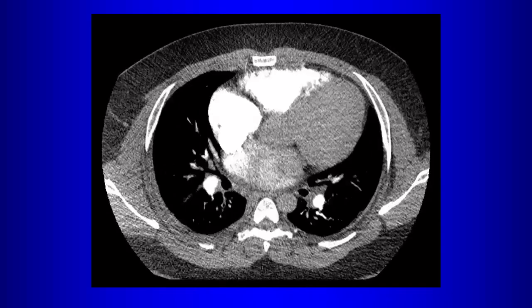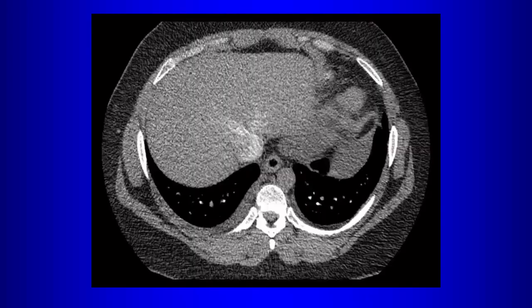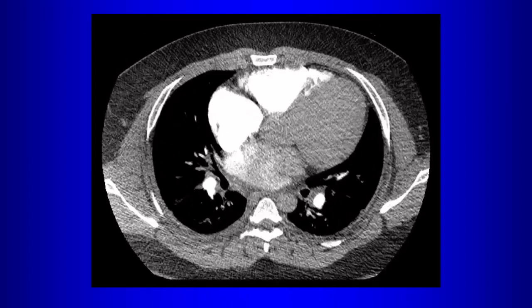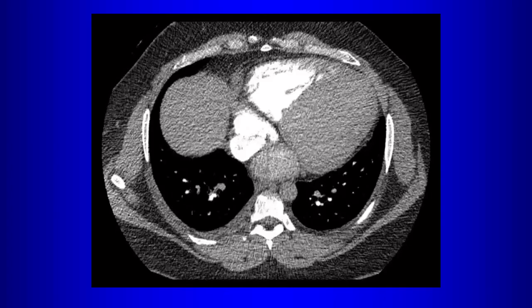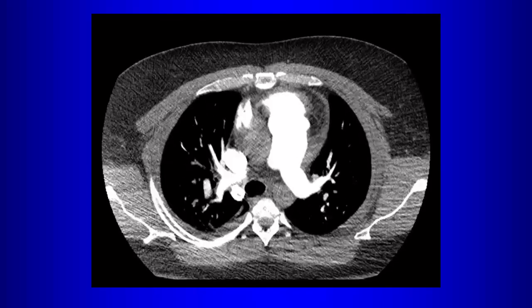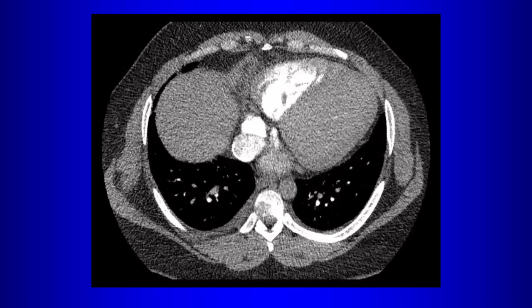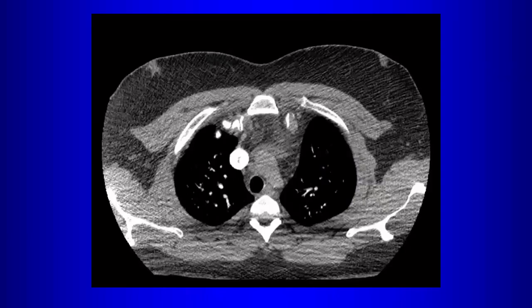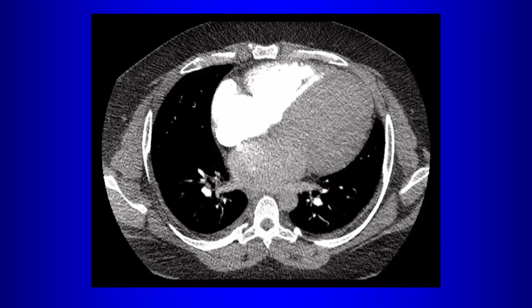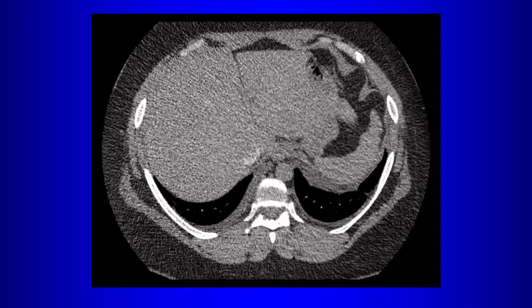It could have just been they scanned it early, though, right? Well, what's the protocol for scanning? How do they know to scan at the right time? They put an ROI over the main pulmonary artery. And then what happens? Then the patient goes in, right? You haven't quite explained what happens. So you put an ROI over the pulmonary artery, so what? First of all, what do we call that?